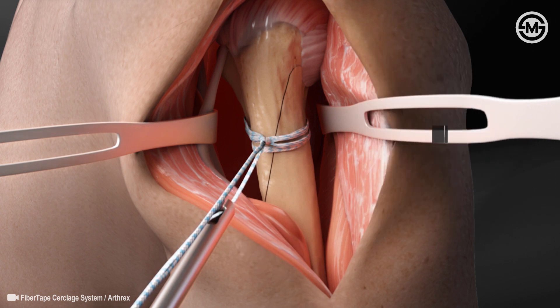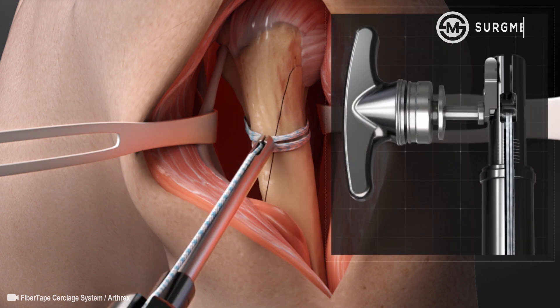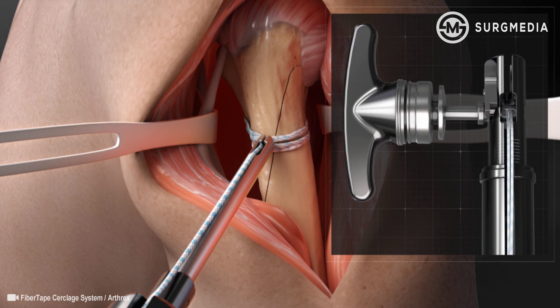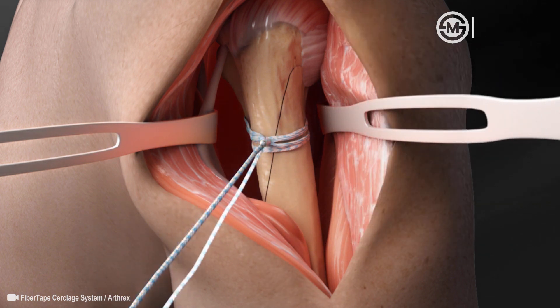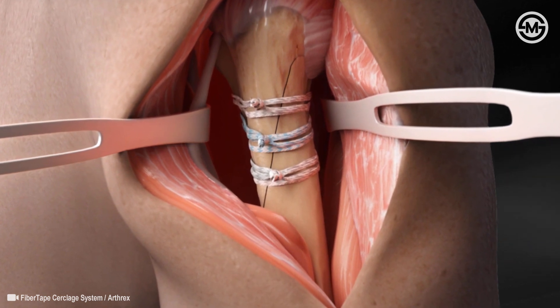The tensioner is pulled back and a half hitch is added. Again, the suture is loaded into the tensioner and the half hitch is tensioned to the desired tension to lock down the repair. Two alternating half hitches are then added by hand and the suture tails are cut, completing the cerclage suture placement. Additional cerclage sutures can be added depending on the size of the fracture.